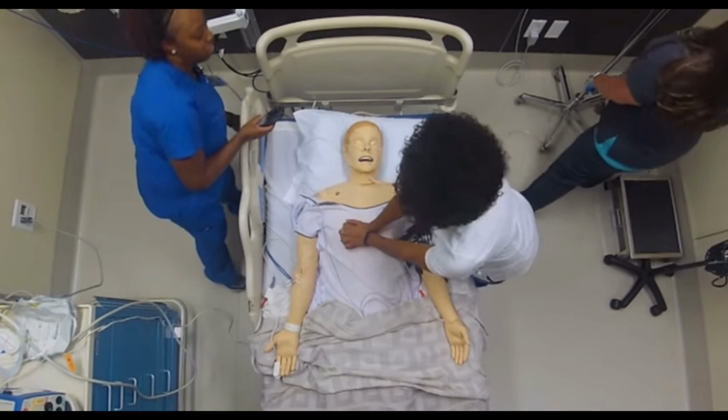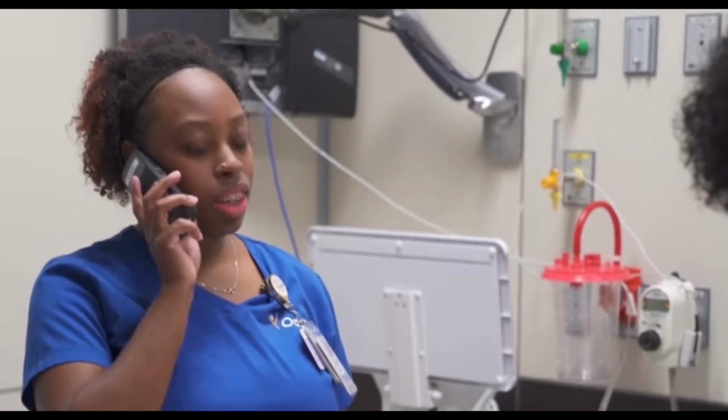Calling a code. The patient's condition deteriorates and the code team is activated. I have a code blue.